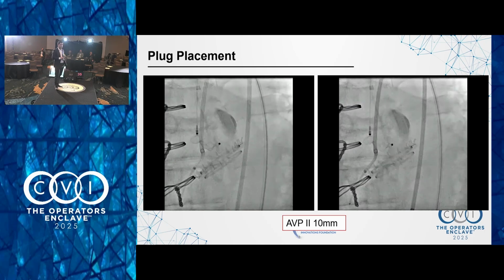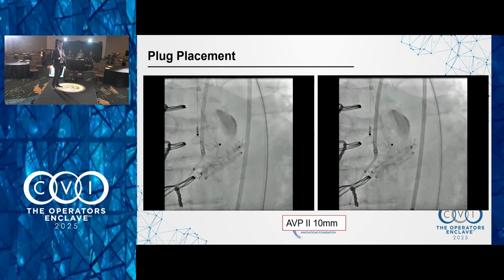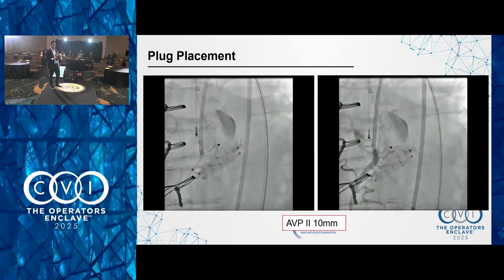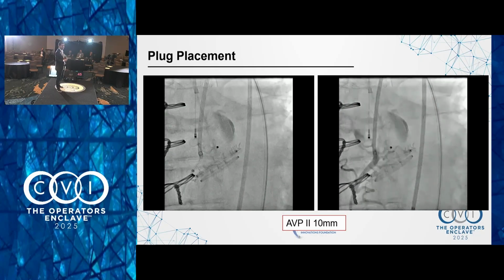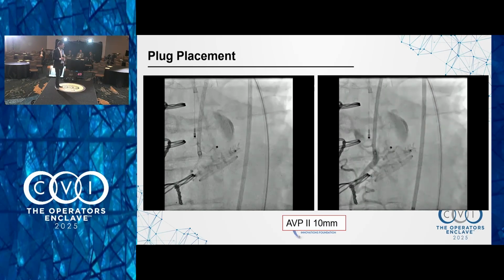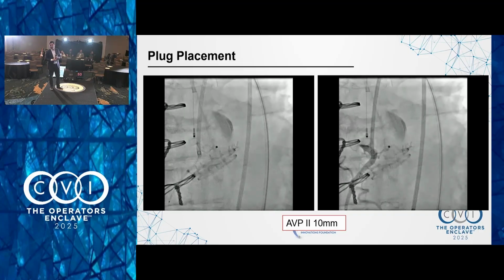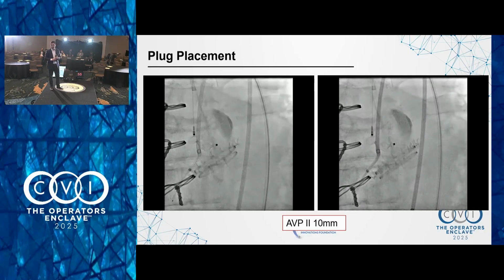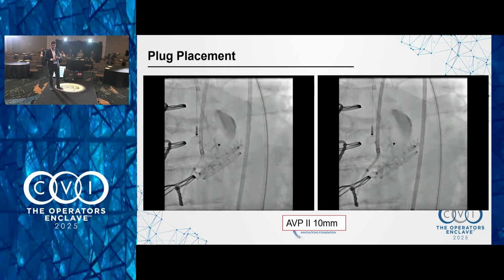Cordis was actually the only one able to put the device through, and I don't know why. If you look at the diameters, they say they're all equivalent, but they don't match up. No, for sure not. So the Cordis 6 will go. It's interesting for LVAD exclusion. I put an 8 French, I put a 16 or a 14 through it for the LVAD graft, and that's where the Cordis actually has a smaller lumen diameter. It's the opposite.